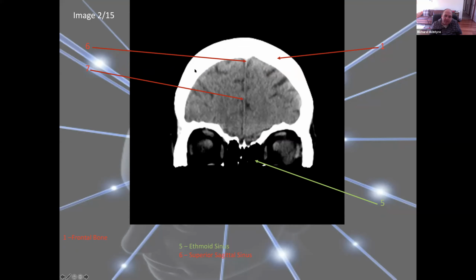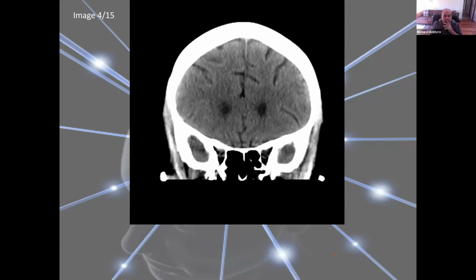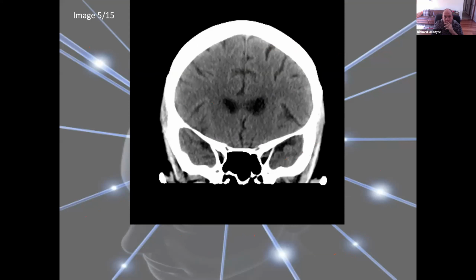We're looking at CT. This bone has absorbed the radiation. Coming back. Pretty much the same structures that we saw, okay. Nothing overly remarkable there.